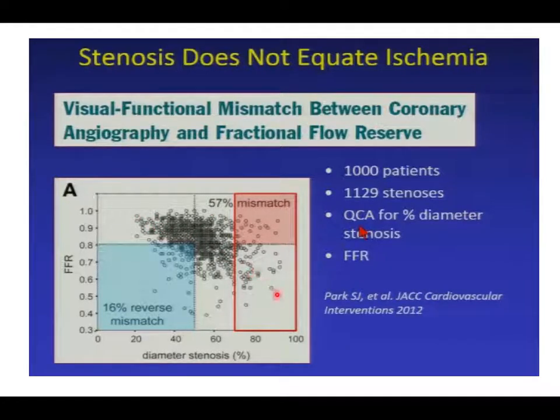So it's kind of a messy number. This was decided as the threshold, but you can see that putting a threshold through this data and saying it's 0.8 as a precise number is kind of strange, right? Because the natural distribution of the values is so high.